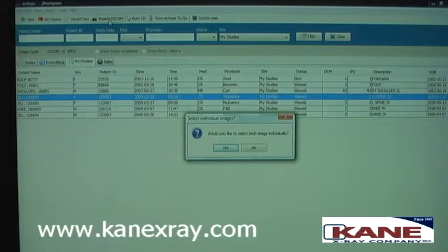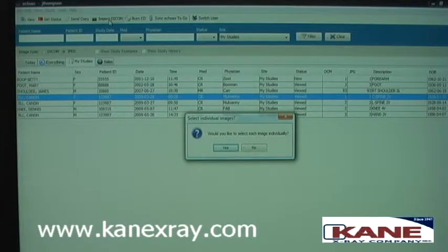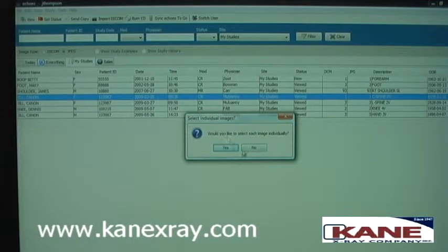The system will prompt you if you'd like to import each image individually. The answer for this is usually no, since you want to import all of the images in that study.